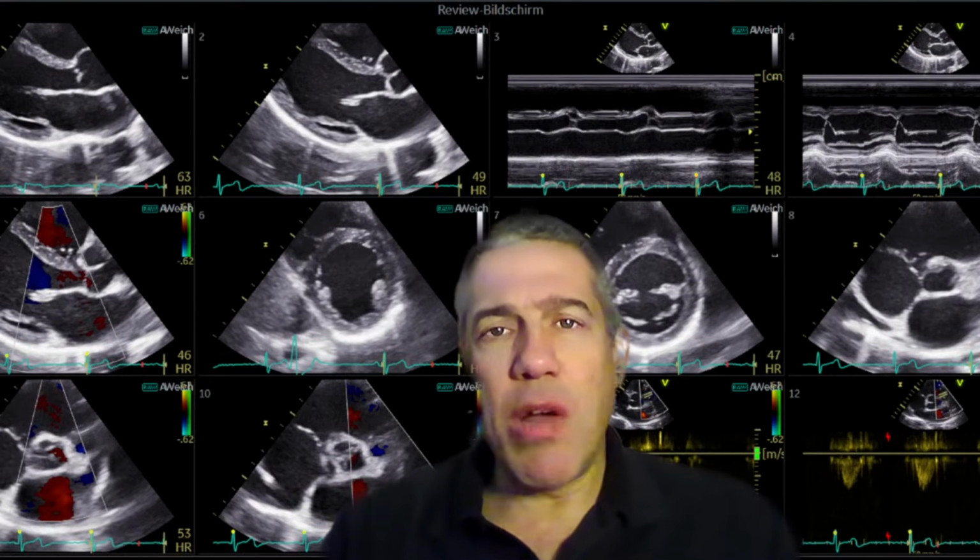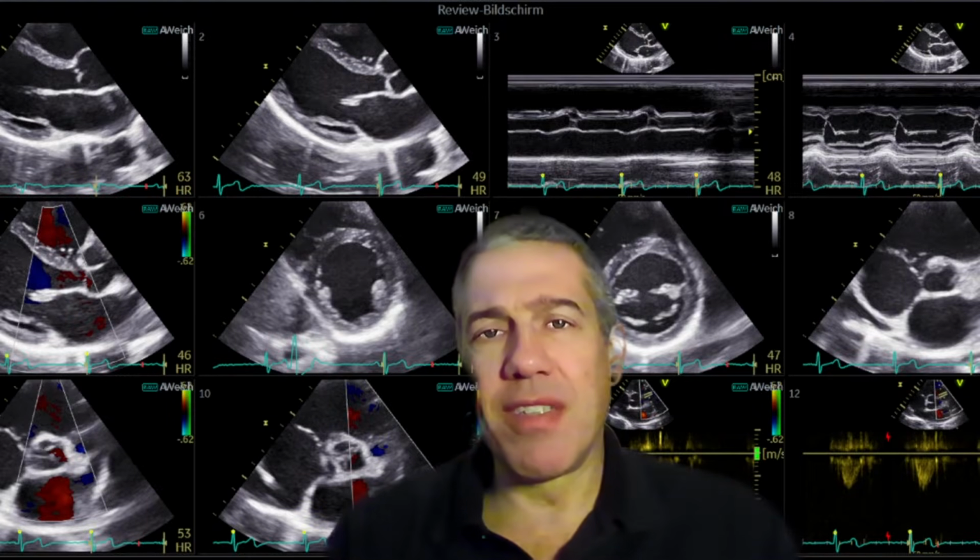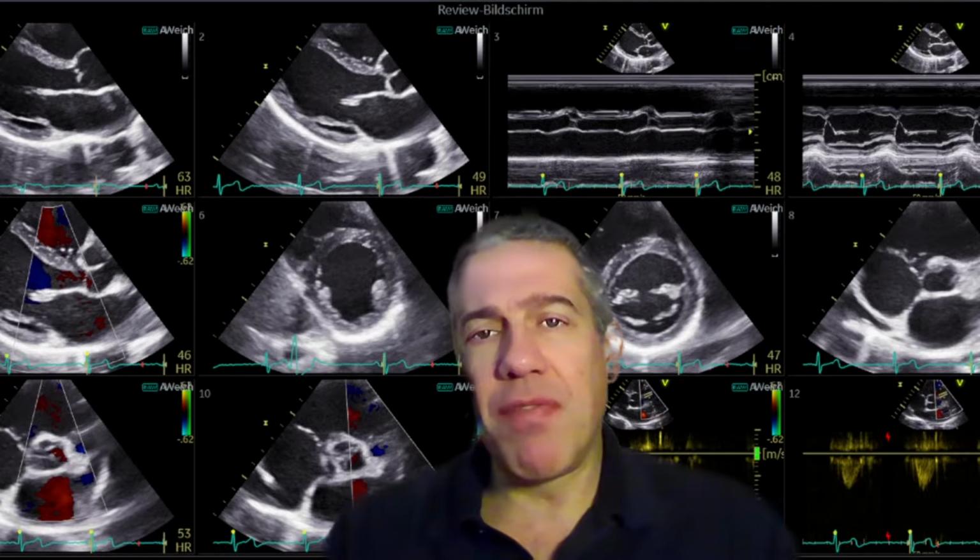Today I want to share with you a standard 2D echocardiography exam. I will try to show you what to focus at, how to interpret the single planes, the views, and how to do the basic measurements. We will examine a 50-year-old healthy female.